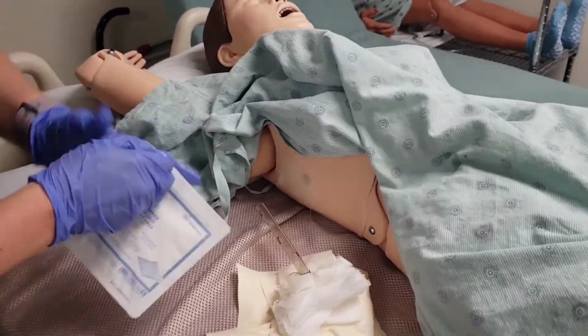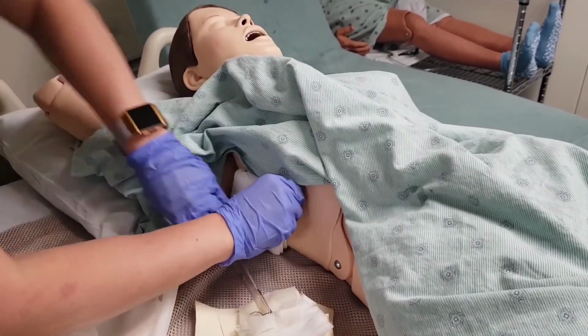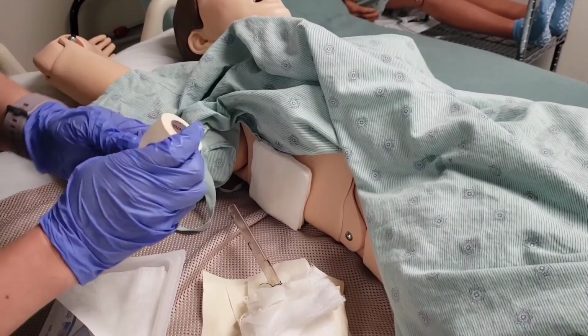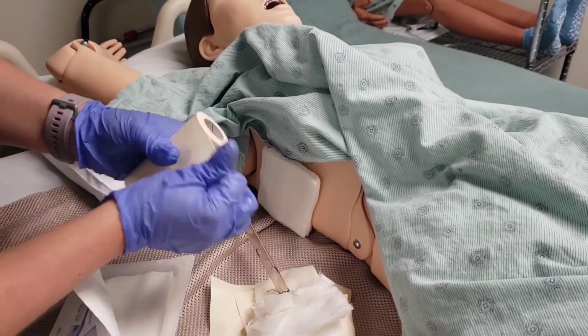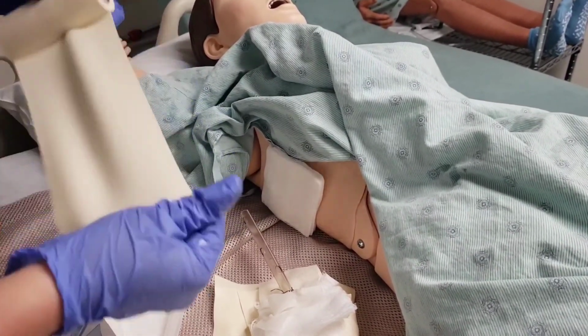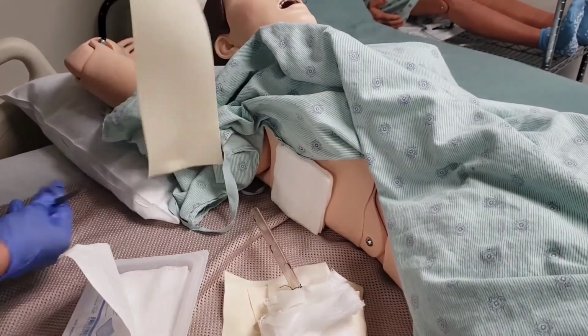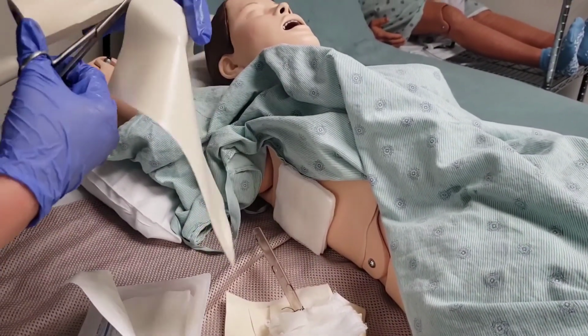Next, place your 4x4s over the dressing. Use some tape to hold everything in place. Call the provider immediately. Stay with the patient. You do not want them to develop a tension pneumo while this is going on. We have covered up the hole and there's no way for the air to escape.